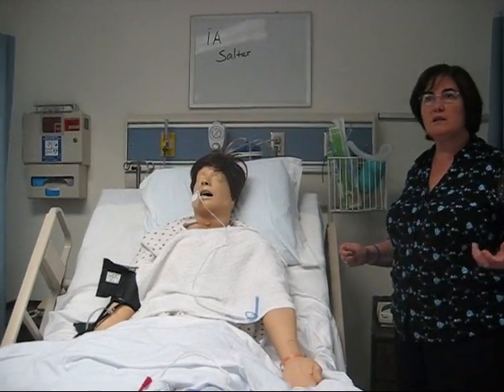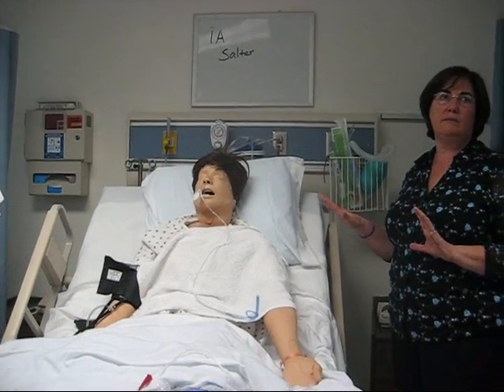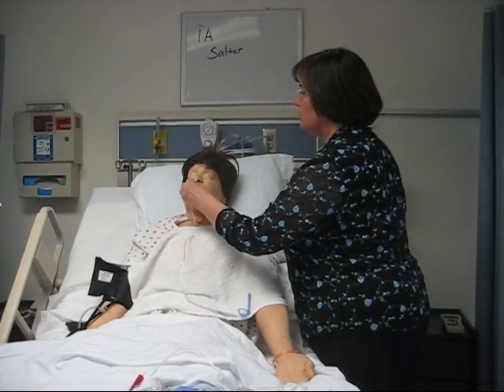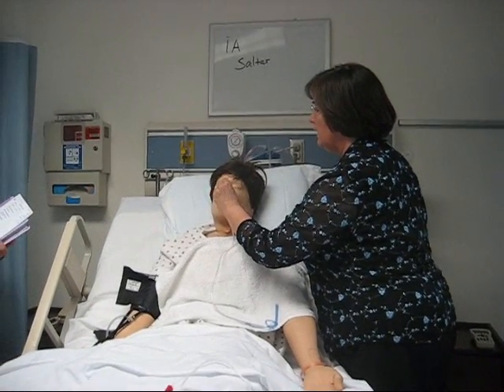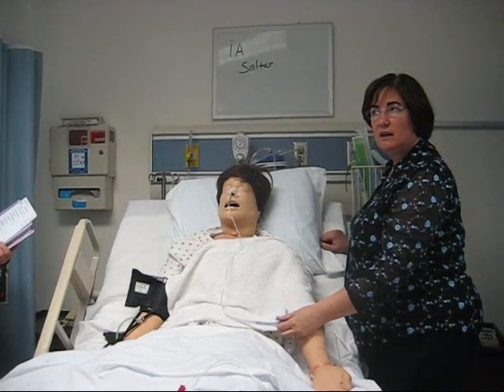I wouldn't be pulling things through it and pushing things through it or any of that kind of stuff because I already know I have a problem. All right. So I could reposition the tube. And now, because I am repositioning, I do want to know that it is actually down far enough.